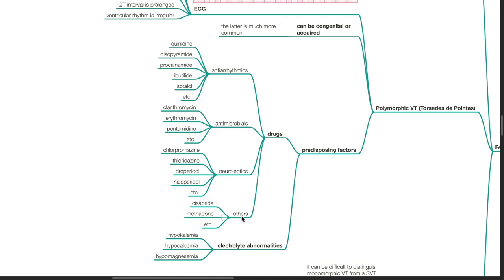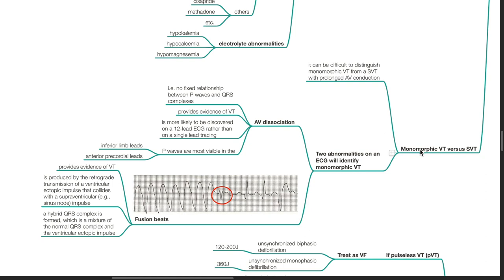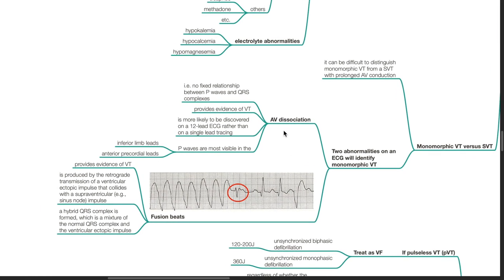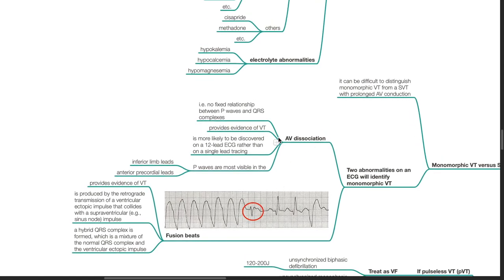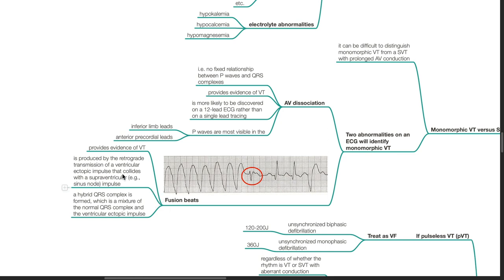Electrolyte abnormalities can also predispose to Torsades de Pointes, such as hypomagnesemia, hypokalemia, and hypocalcemia. Distinguishing monomorphic VT versus SVT: two abnormalities on ECG identify monomorphic VT — AV dissociation (no fixed relationship between P waves and QRS complexes) and fusion beats. AV dissociation is more likely discovered on a 12-lead ECG; P waves are most visible in inferior limb leads and anterior precordial leads. Fusion beats are produced by retrograde transmission of a ventricular ectopic impulse colliding with a supraventricular impulse, forming a hybrid QRS complex.